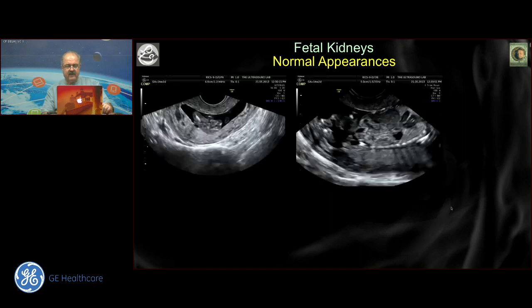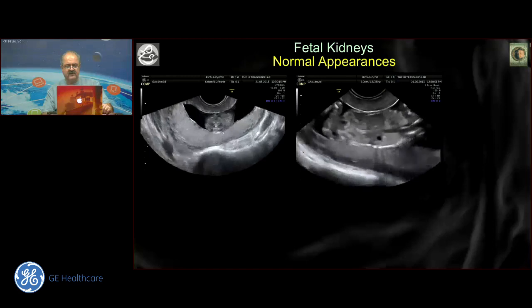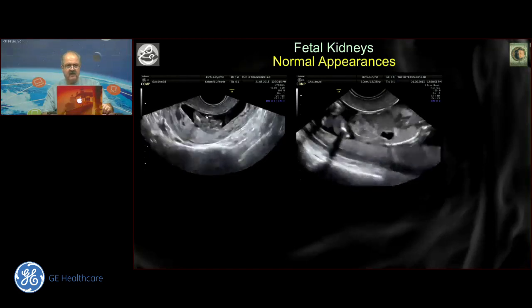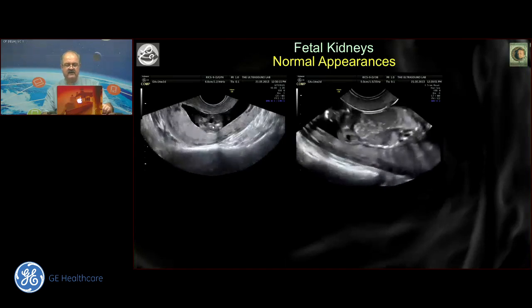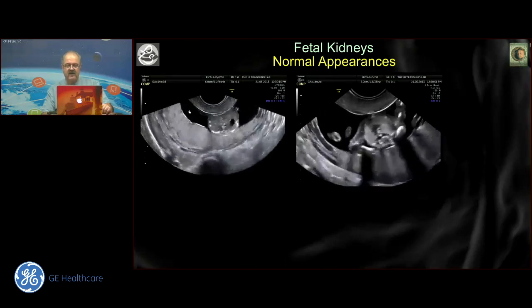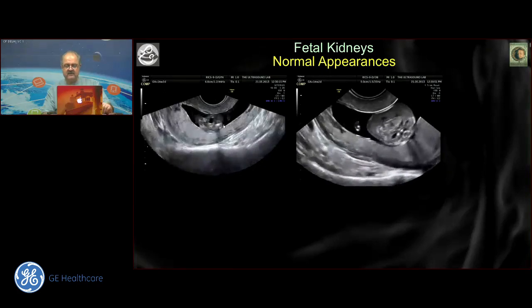The tendency for many of us not to magnify is a little difficult to understand. We often give images like this where we say, oh yes, this is beautiful, I see iliac wings, I see the kidneys here, I see stomach here, and so on. But it's not wise to do things like this. We must make sure that the area of interest occupies most of our screen. And that way you should be able to see it much better.